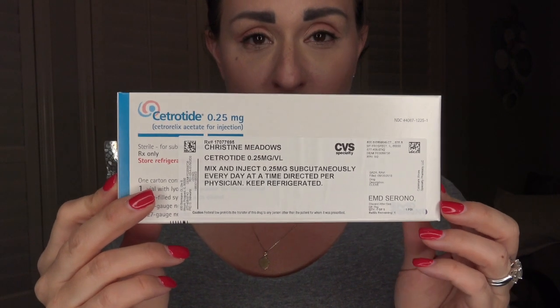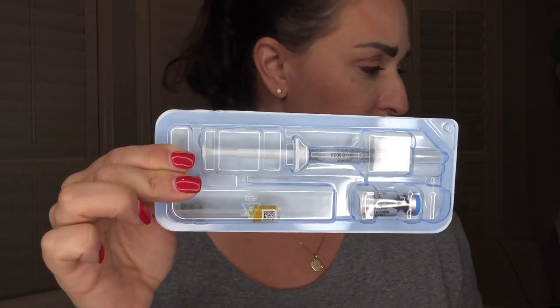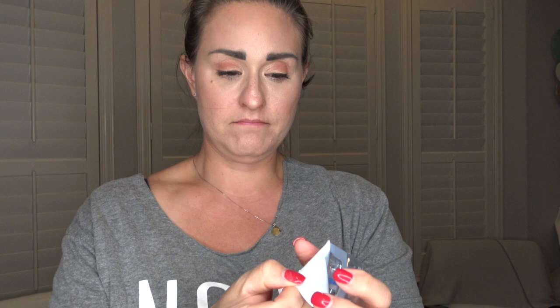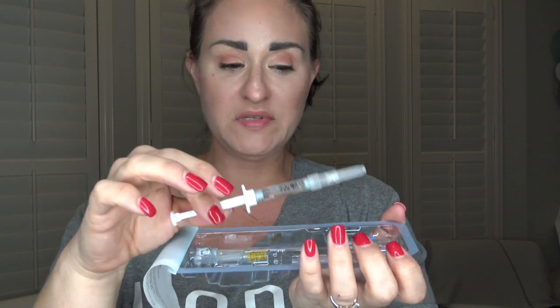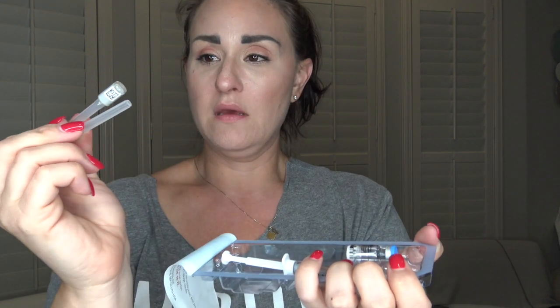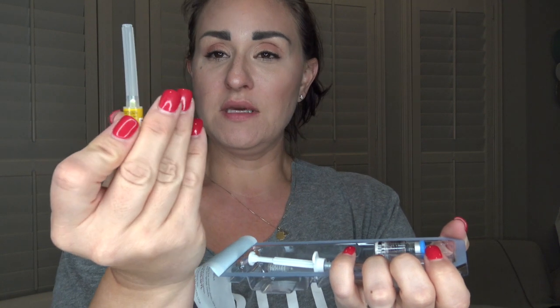When I opened this box I was like, 'Oh man, I don't know if I can do this,' but it's actually quite fine. You're going to open your package and out comes everything you need for this injection. You'll find a syringe already filled with sterile water, your medication vial, and then two needles. The gray one is the injection needle, and this yellow one is gigantic and scary looking — but I will show you what it's for.